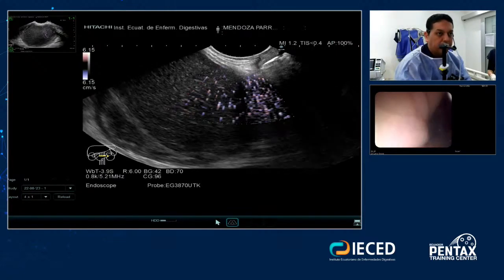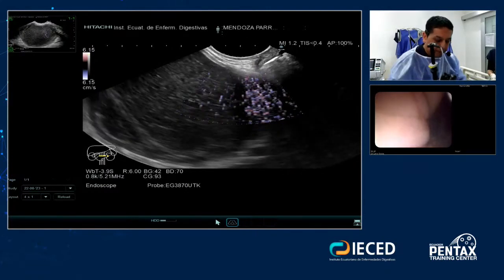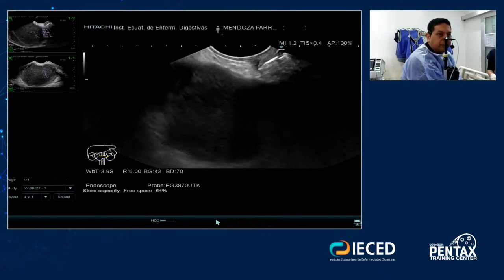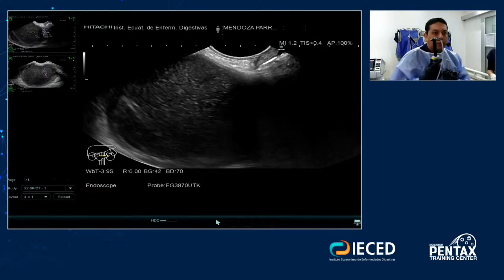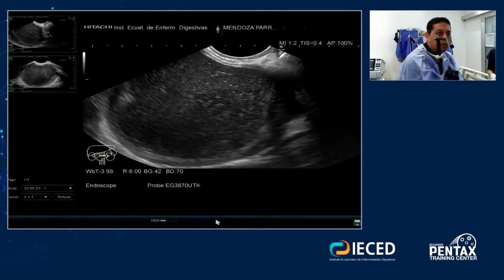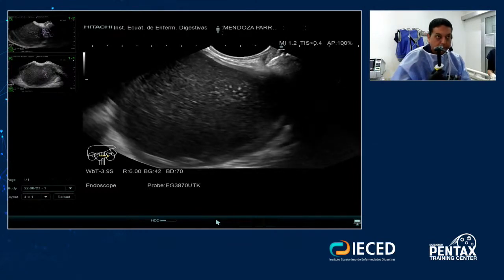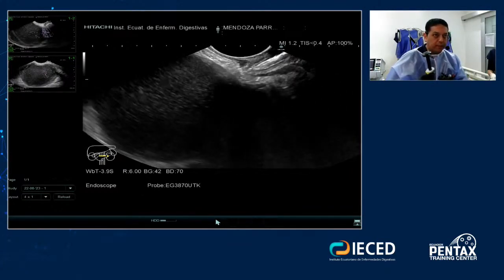But first, before that, we need to see if there is any vessel. So I am very sure that there is no vessel, and I can work directly now. The second point is that it's easier. There are 4 steps that we need to follow, and I will do it. Just 1 second. I want to have a very good position now. I'm not inside.